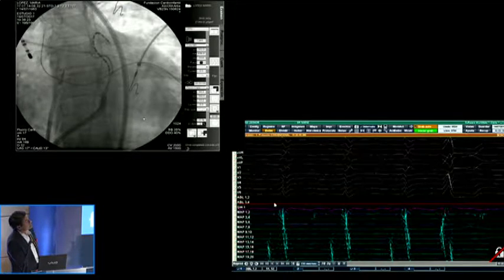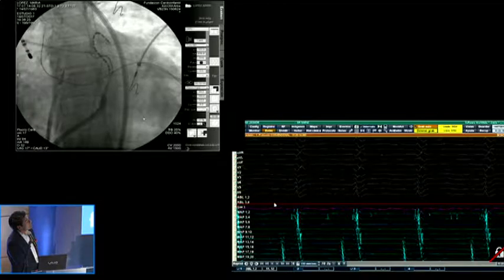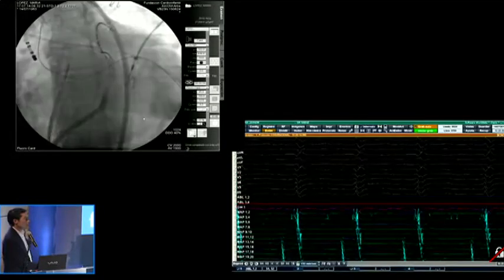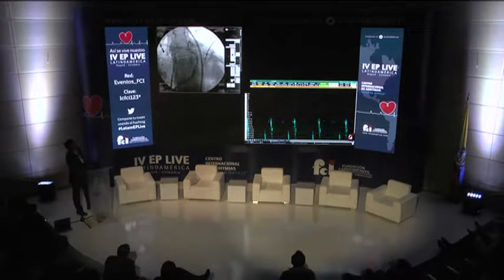Well, here you have one further up. Fermin found one further up, but also with a lot of A. 1314 has A's as well, so let's not rule it out. If you want to stimulate from the guide wire, since there are no extrasystoles, no, it's below 1314. Yes, it's too proximal, I think.